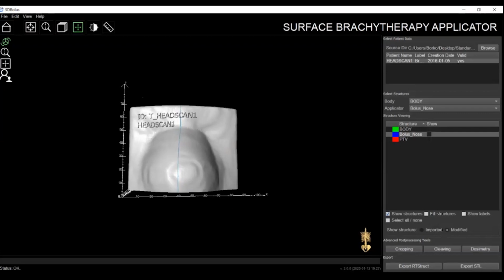Rohit? Yeah, thank you, Borko. It's a great overview of the new features and existing ones as well. So as you mentioned, we can go right into the questions that have come in from the audience. So let's start.